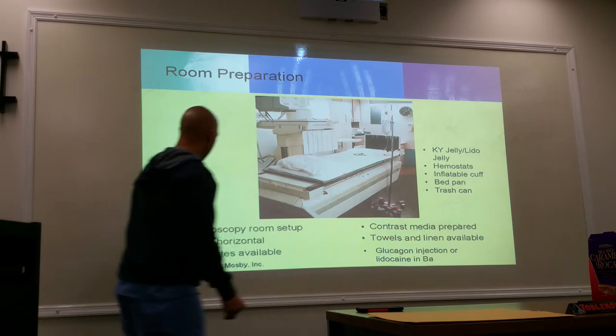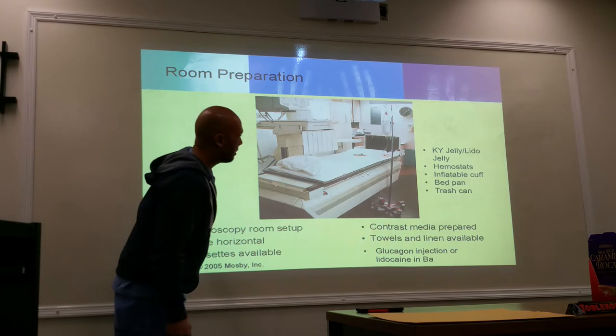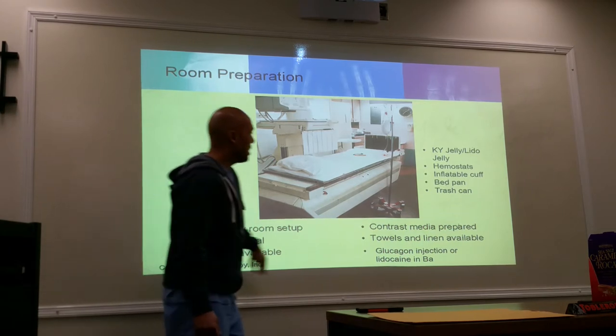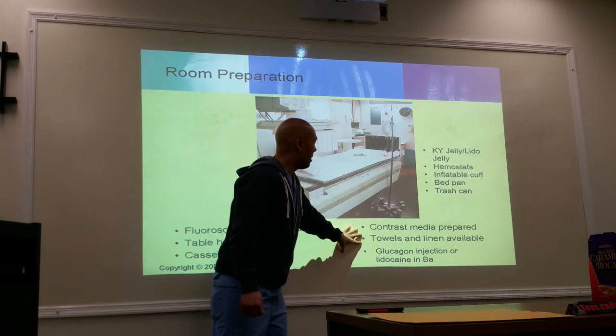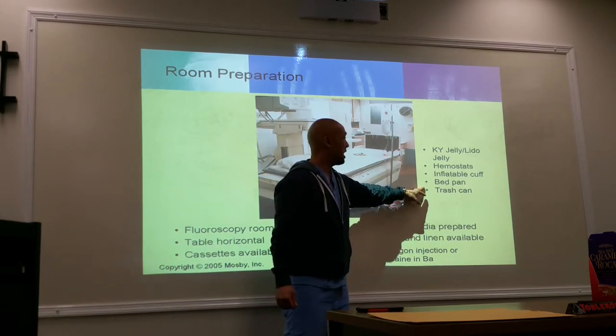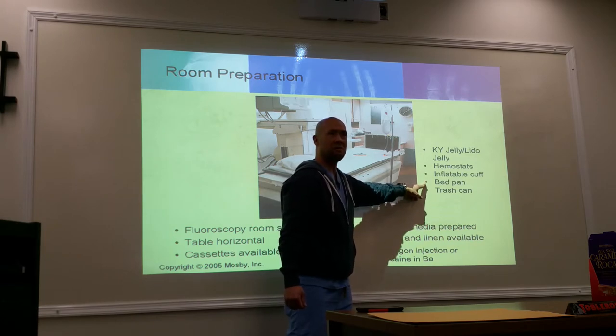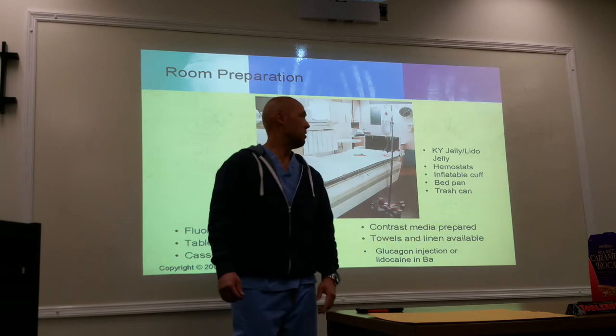Other things that you need to have in the room. The table is horizontal. Make sure you have all your cassettes available, your image receptors. Have your contrast media ready to go, towels, linens, napkins, okay, a bedpan, and have a trash can ready. These are new. I think I added these. Put bedpan on there. Have a bedpan. Have a trash can available.